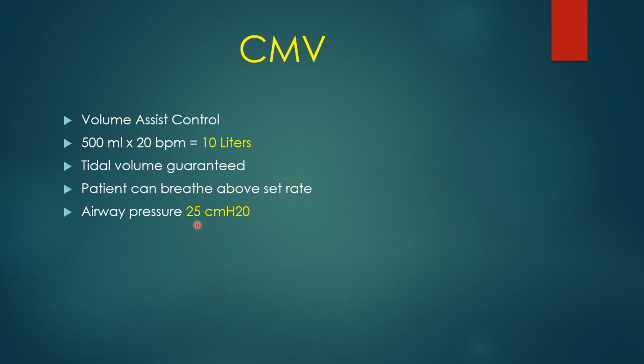So something has made it so that it takes more pressure to put that air in the patient. This is very often one of these two forces that oppose inflation of the lung. One is the resistance to airflow through the airways. If he has a lot of secretions, needs to be suctioned, those increased secretions cause a narrowing of the airways, and so the airway resistance is increased.